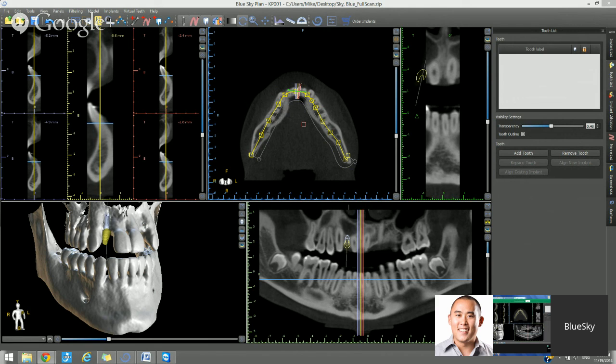Okay, I know I ran through a bunch of different topics, some of them more advanced and some of them less advanced, but at least this should provide a base that you could go ahead and play with the software, try cases out, use the functionality, and you should have a strong basis for doing that now. If you want further assistance, as we mentioned earlier, there's a very detailed help file in the software at Help, Show Help. There's video training tutorials on our website. There's also recorded webinars. This one's being recorded as well. And you can contact me with any questions or to schedule a time to go through the software together.